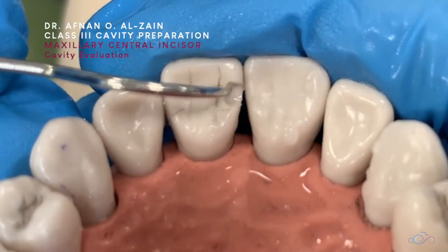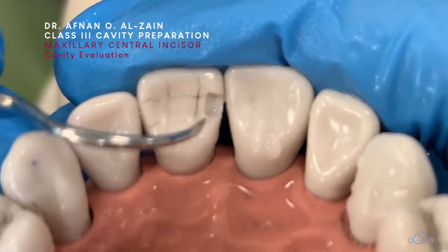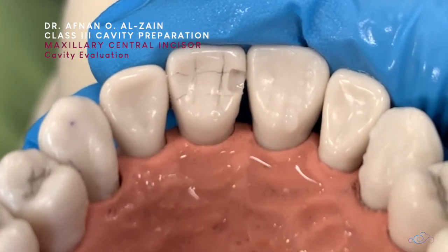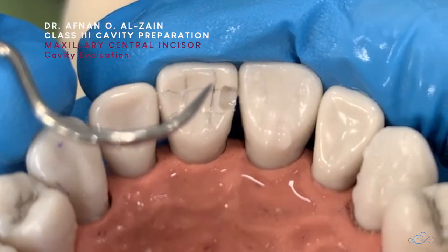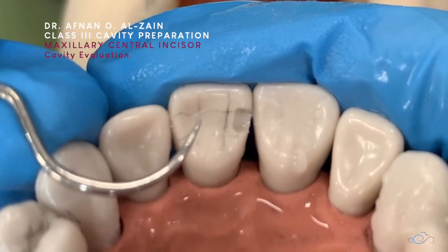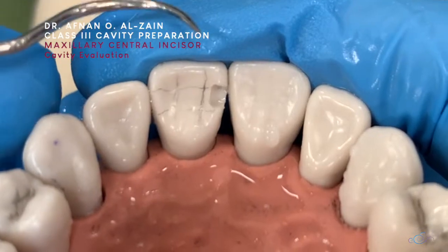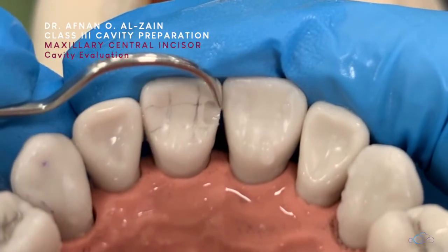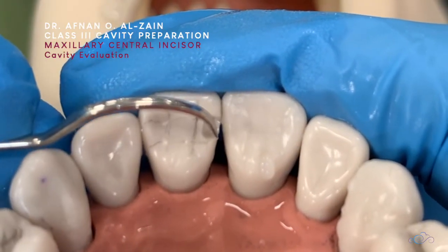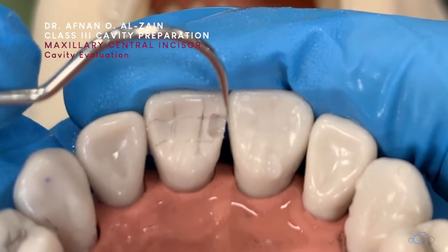You can see here all the walls are defined. Everything is smooth, there's no catch. And we already checked the depth that it is 1.5. So we can see here that the cavity is within the middle third. It is not deep axially, to protect the pulp. We need to make sure that it is not extended too much, incisor and gingivally. We can check if there is clearance. Extension incisally is not necessary if there is clearance.